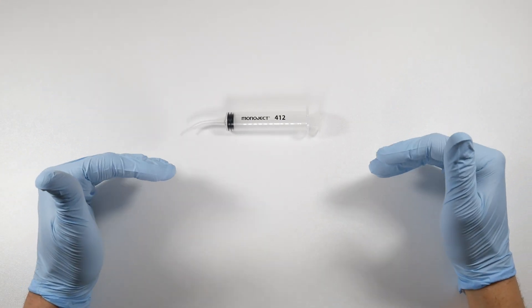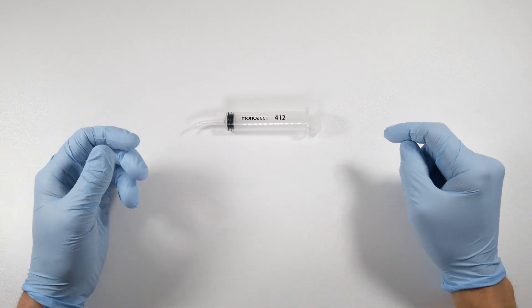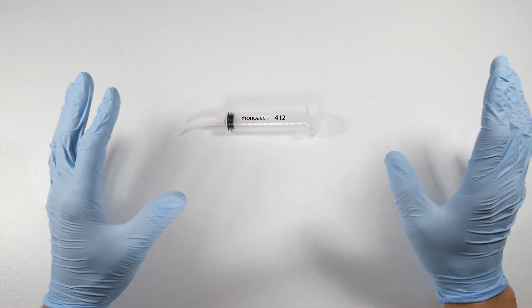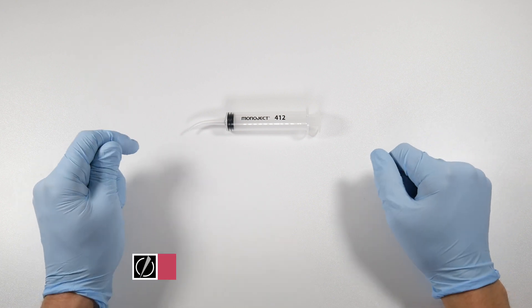Throughout the course you've been hearing me talk about irrigating sites once the tooth has been removed. I haven't really gone into the specifics of irrigation, but that's what this video is for.